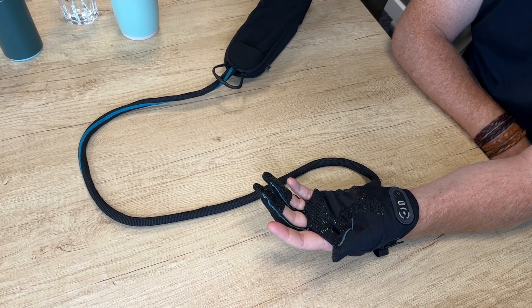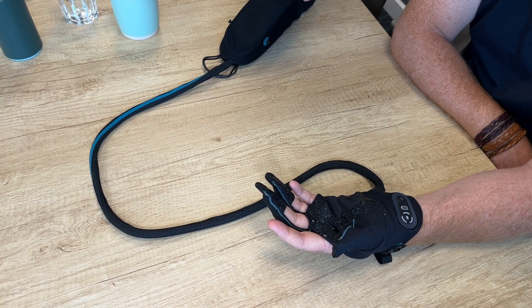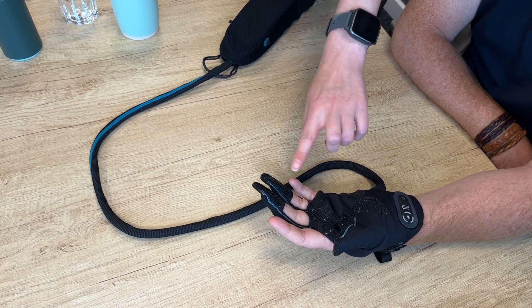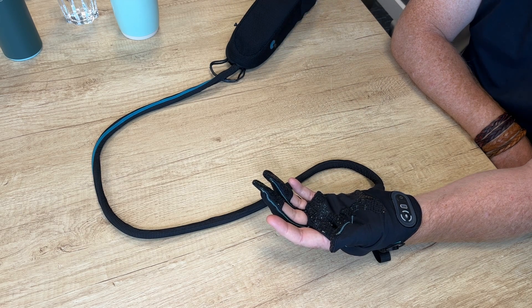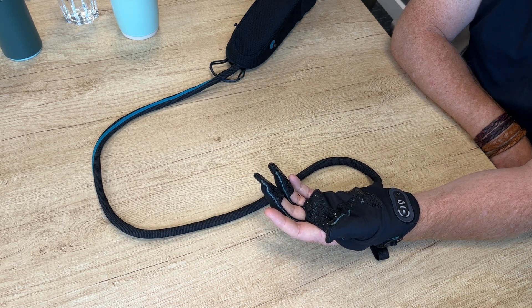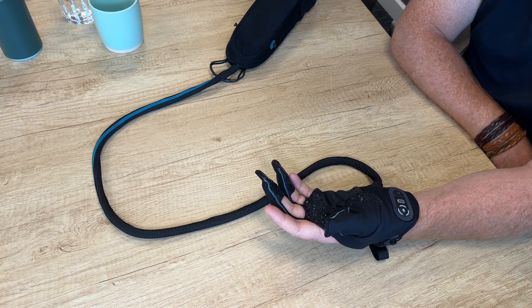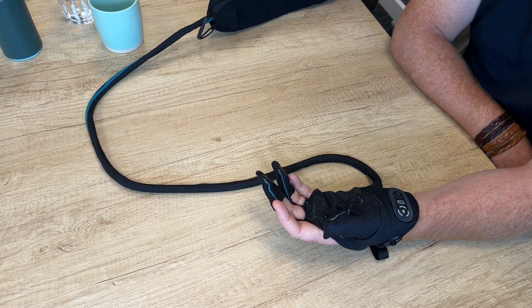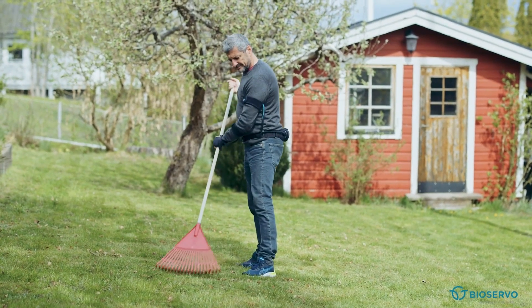The device is designed for one-handed use. Inside the pack are the motors and battery. The glove covers only three fingers rather than all five because adding two more motors and extra battery would make it less practical as an everyday device. Covering the full hand also reduces sensory ability — you'd lose the sense of touch and the ability to feel hot surfaces, which is an important reason people reach out or release objects. The pack can be worn around the waist like a bum bag, on your back like a backpack, or hung on the back of a wheelchair.